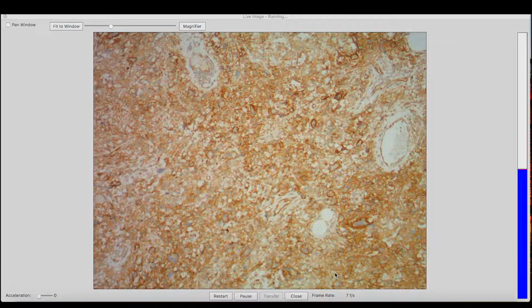In terms of its clinical setting, upper back is certainly a good spot. Virtually 80%, 85% of pleomorphic lipomas occur in the posterior neck, upper back, or shoulder region, usually in middle-aged males, and I believe this individual was a 60-year-old male, so that's a pretty typical clinical-pathologic setting. But from a histologic standpoint, this particular case is a little more difficult because it's so cellular, there's really not that much fat, and it's missing the eosinophilic ropey collagen that's characteristic of this lesion.